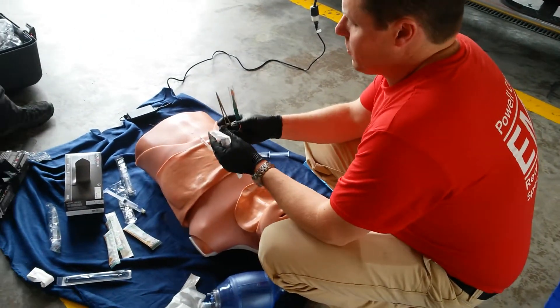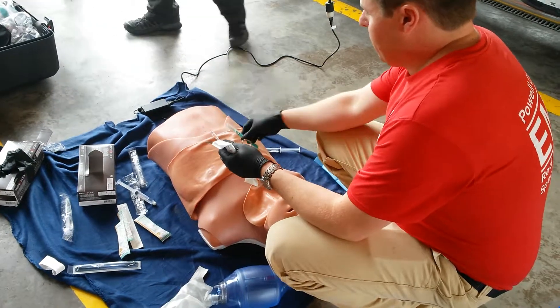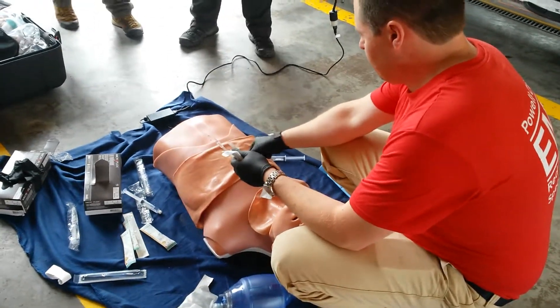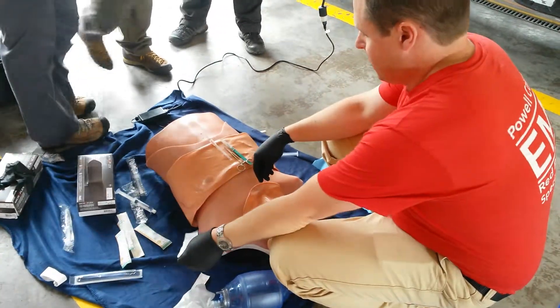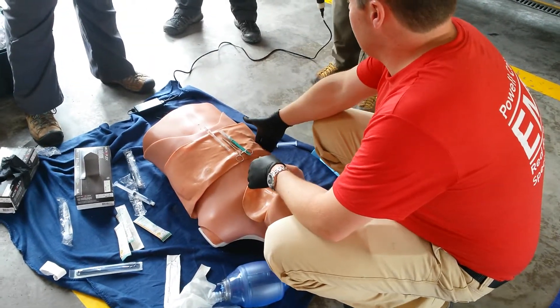All you really need for this — they have these giant kits, you don't really need much. Preferably you'd have a curved Kelly set, just because it makes it easier. And a scalpel. At this point, Jason's going to record lead — he's getting a little concerned about the shock and stuff.